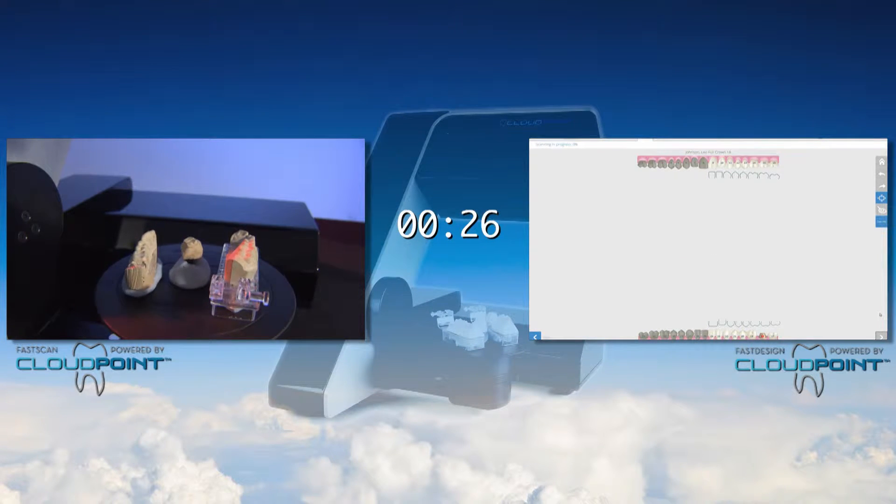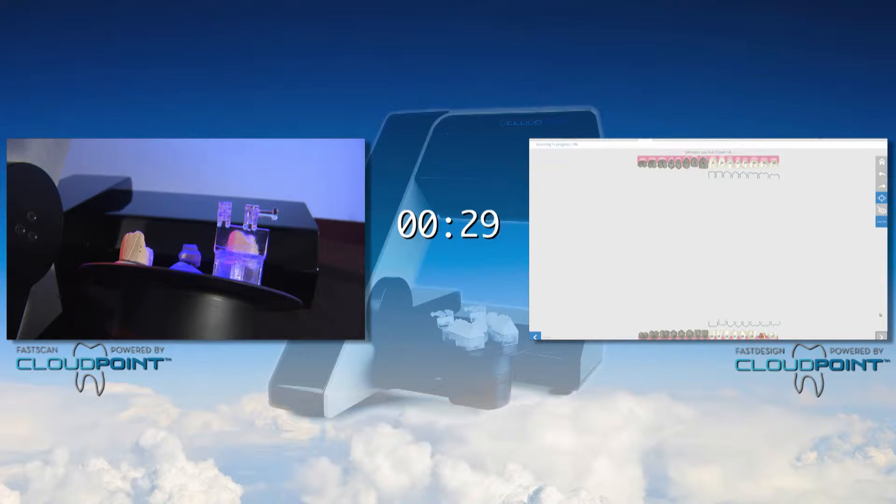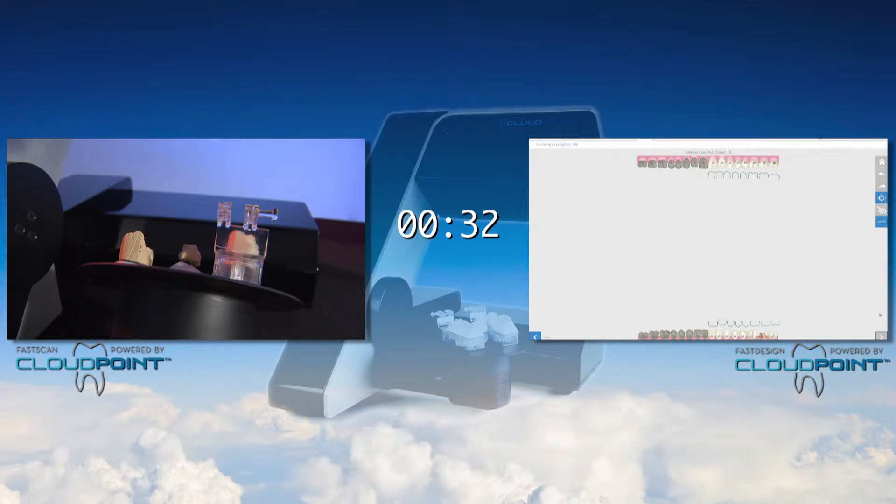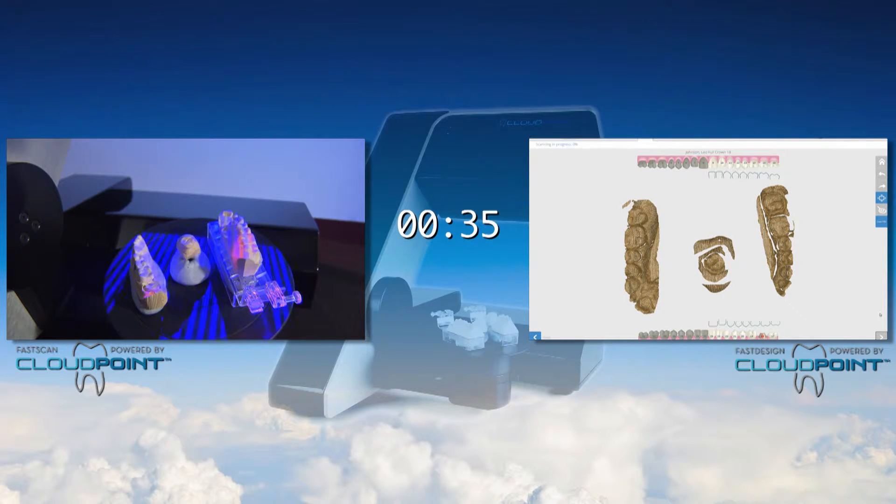A key feature of the CloudPoint scanner is that you are able to scan all of the parts of the case simultaneously. That would be the opposing, the trimmed master die, and the solid model.